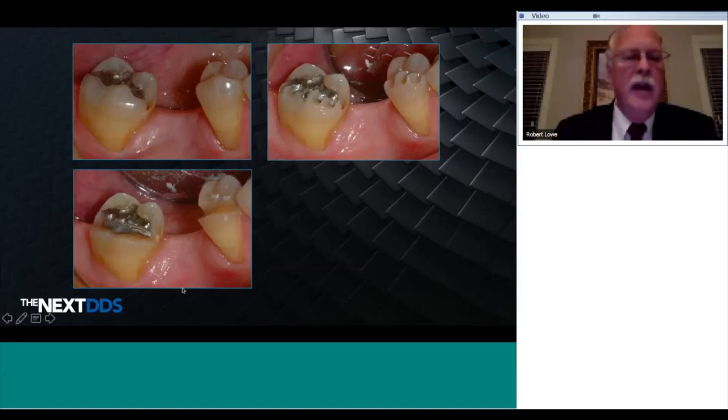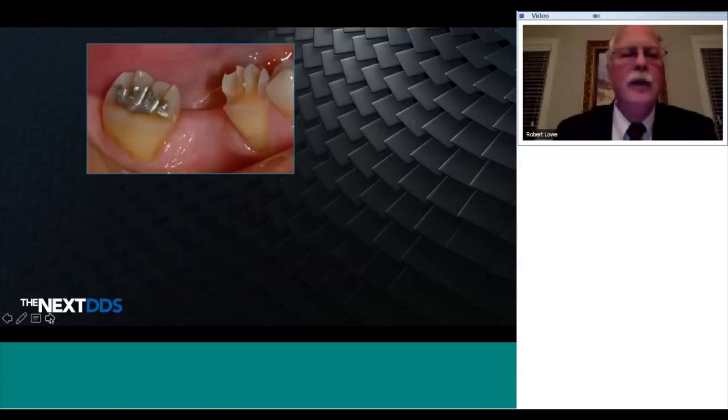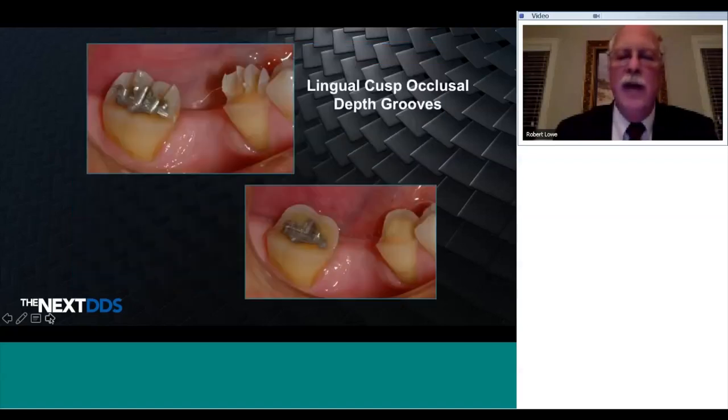This is an area that's traditionally underprepared. I'm from the state of Illinois. I'll tell you, most of the time I look at posterior preparations by dentists, they look like Abe Lincoln's top hats. That's not the way teeth are shaped. If you want to have the depth of the central groove and heights of cusp and actual anatomy in your restoration, you need to prepare the occlusal surface properly. Depth cuts 1.5 to 2 millimeters following natural anatomic contour, and reduce the lingual in the same fashion.